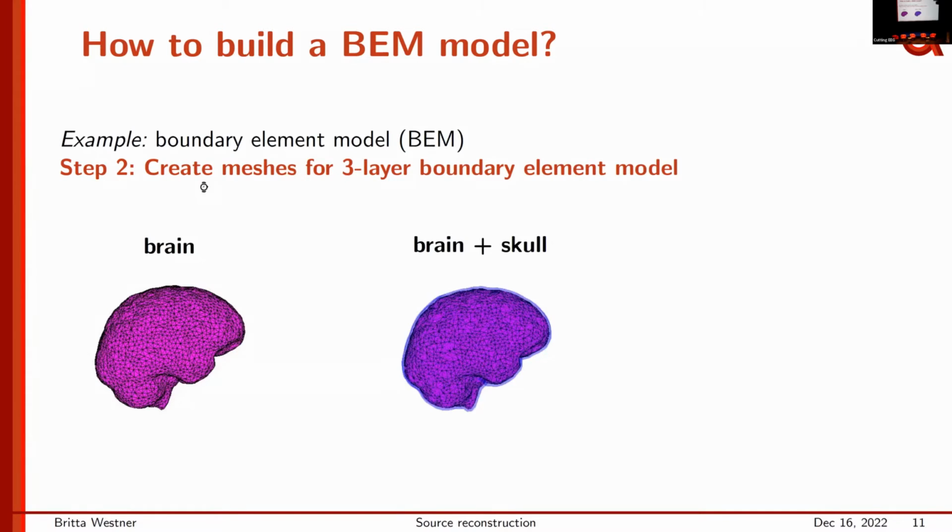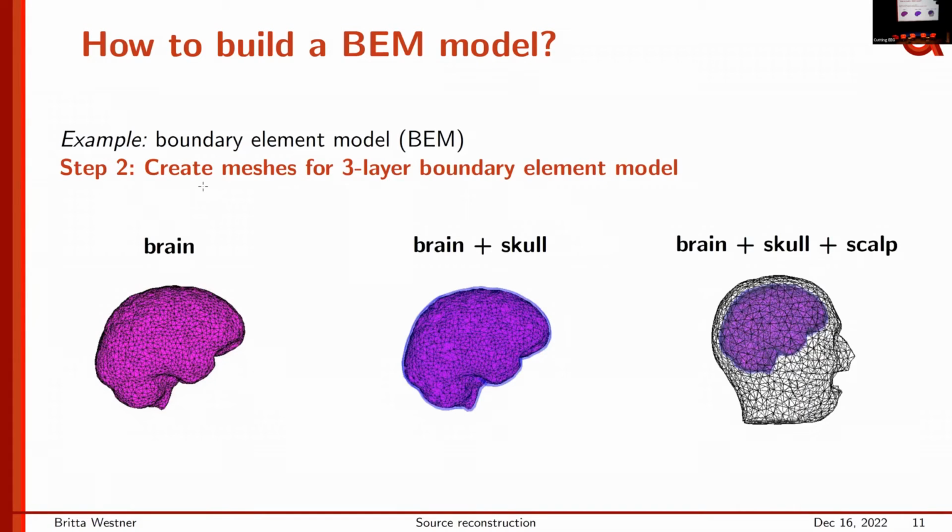And then we add one more layer for the scalp, and that then often looks a bit more like a head shape. This was not a participant that was extremely shocked and scared in the MRI. It's a participant that had a retainer, so we got some cancellation in the MRI from the metal in their mouth. They're doing fine. They're standing on stage.